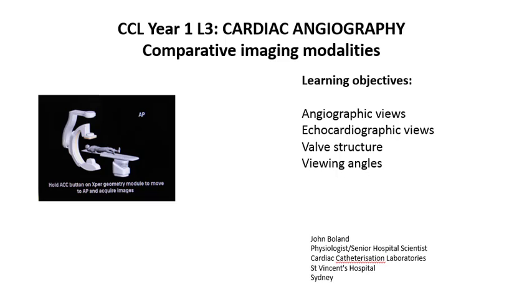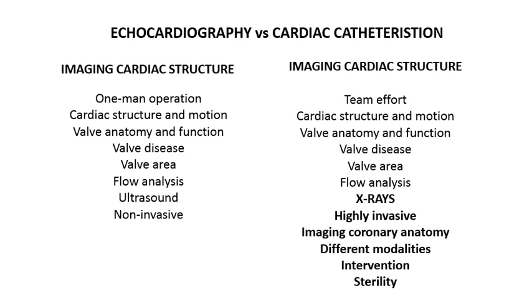And for those of you who may not know, this picture shows you a schematic of a cath lab, basically an X-ray machine that takes coronary and cardiac images of a patient lying on a table. First, let's have a quick look at the differences between echocardiography and cardiac catheterization. They're both modalities for imaging cardiac structures.